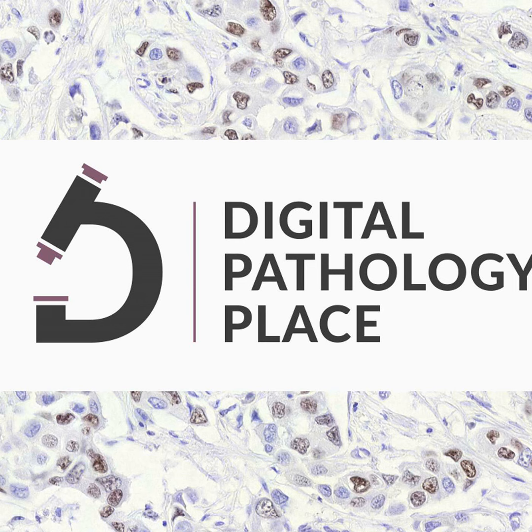But here they also say that viewing software should not allow the original whole slide image to be changed. So you are just viewing the slide. What you can do there, like you can do on your computer screen, you can adjust the brightness, adjust some contrast, but this is something you do under the microscope as well. So this is allowed, not regulated, doesn't have to be documented, because you are not changing the original image. So this is totally fine.